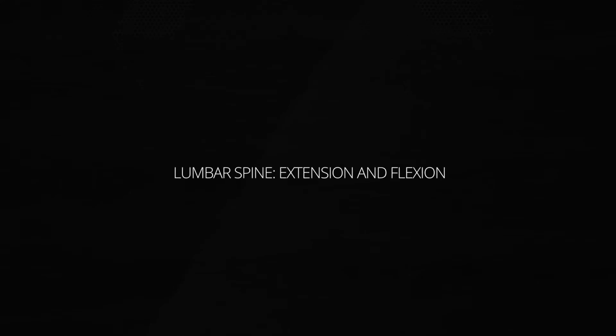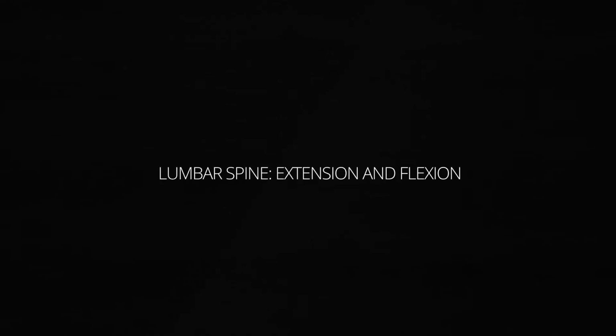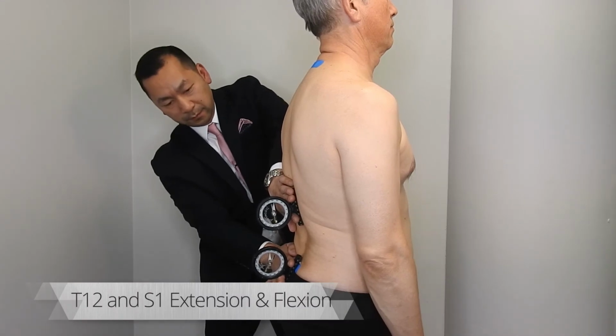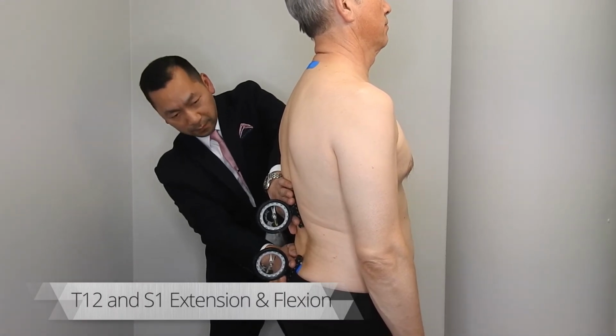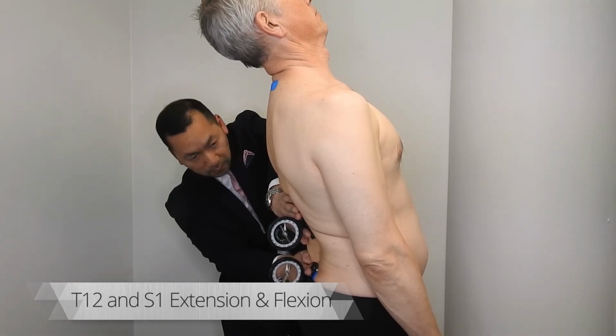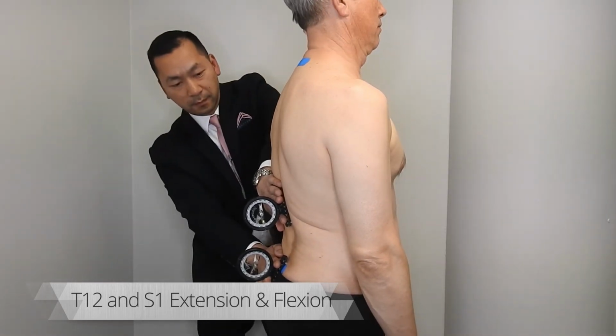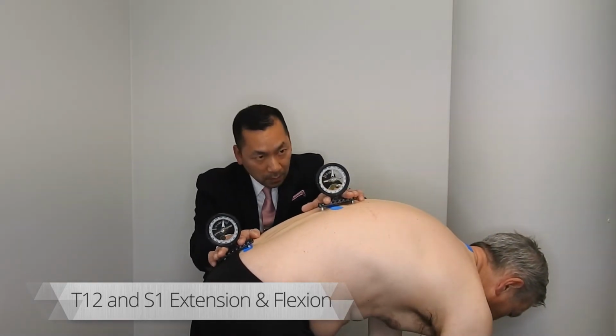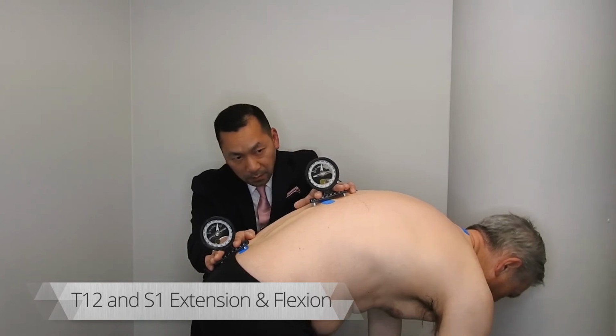Lumbar spine, extension and flexion. Measurements are made between the landmarks of T12 and S1. Subtracting S1 from T12 gives the degrees of lumbar extension and flexion. Repeat these movements at least 3 times each for consistency.